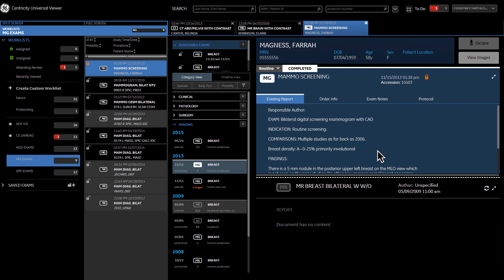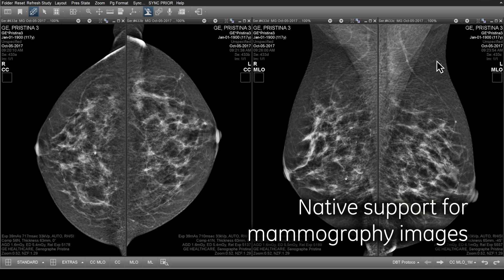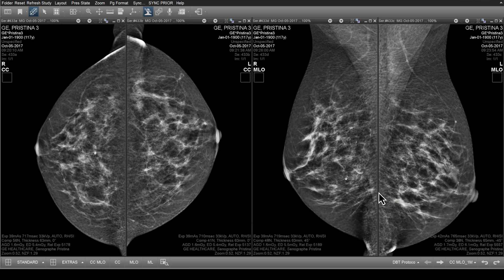Upon opening a mammography exam, images are loaded into the image viewer and automatically aligned to the chest wall. To make reading easier, smart algorithms hide as much of the image background as possible and apply the same scale for all images across the layout. Viewport annotations are positioned to avoid overlaying the breast tissue.